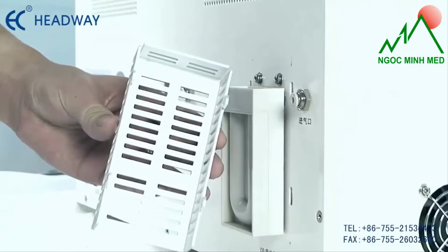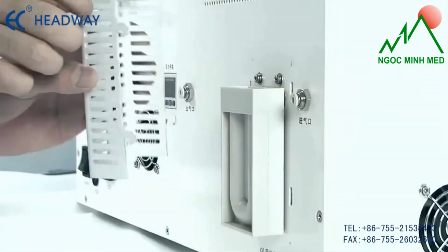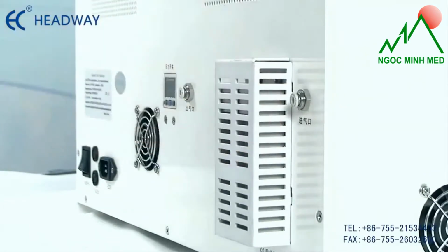Insert the filter cover into the bayonet of the instrument backplane. Push down the filter cover. Make the instrument backboard stuck by the filter mask.